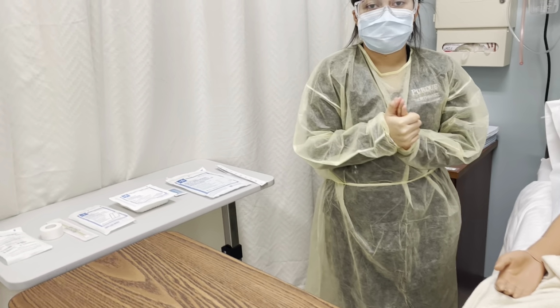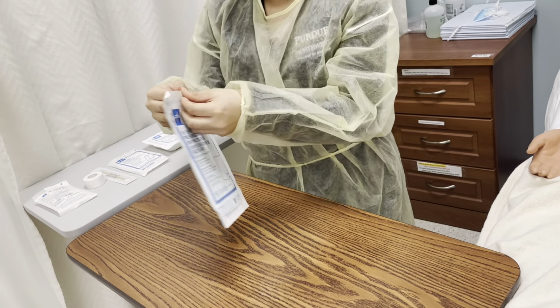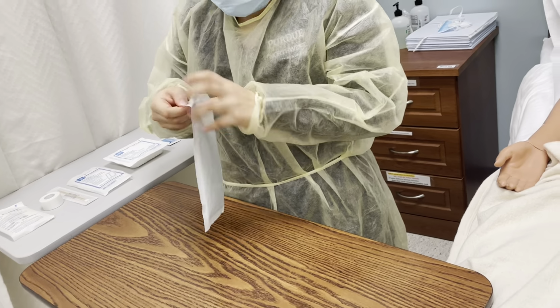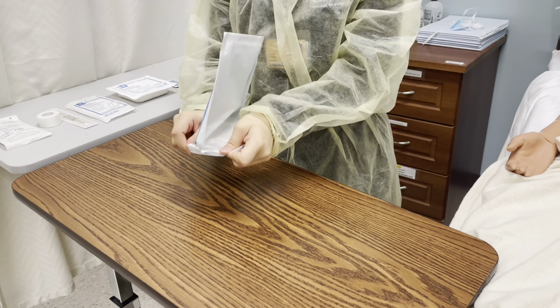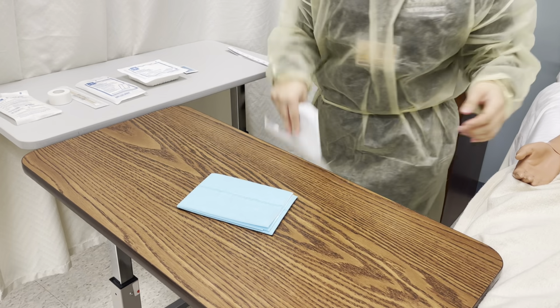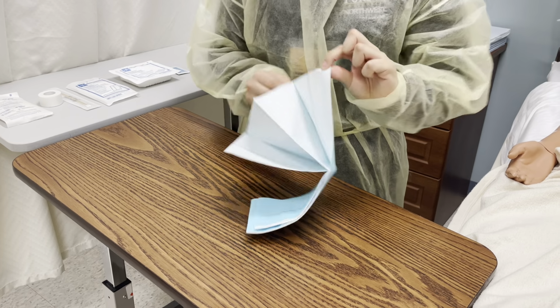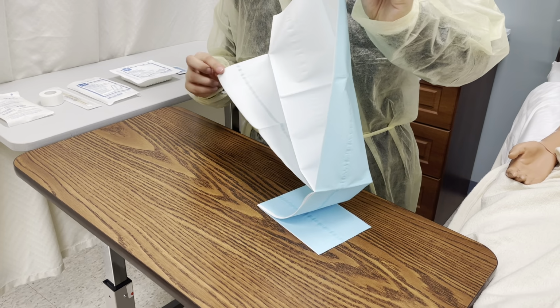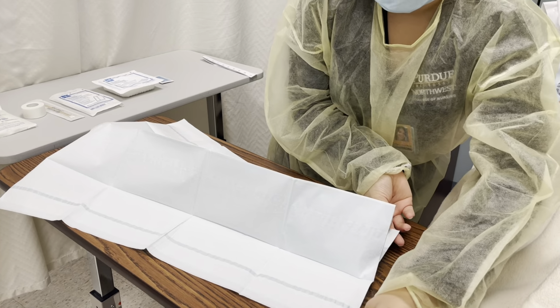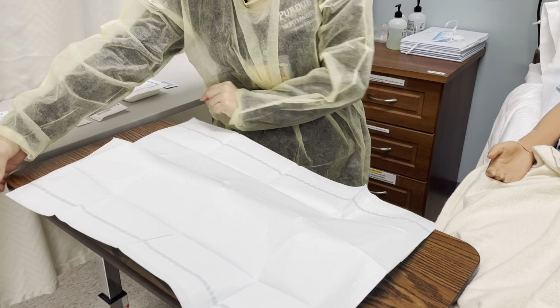And I'm going to go ahead and set up my sterile field, starting with my drape. Hopefully I can get this open. Okay. I'm going to open away from me and drop onto the sterile field. I'm going to go ahead and throw that away. Using the 1-inch barrier that I have, I'll open up my drape, not reaching over, making sure not to contaminate it.